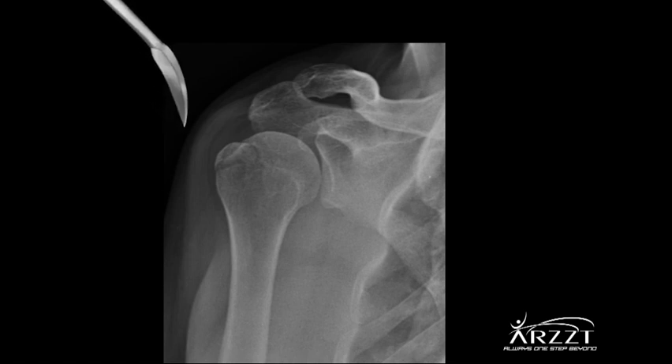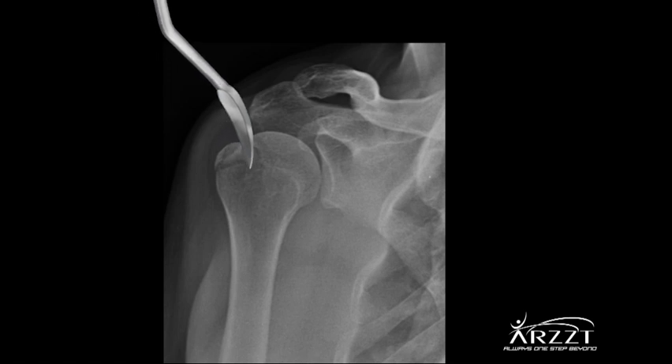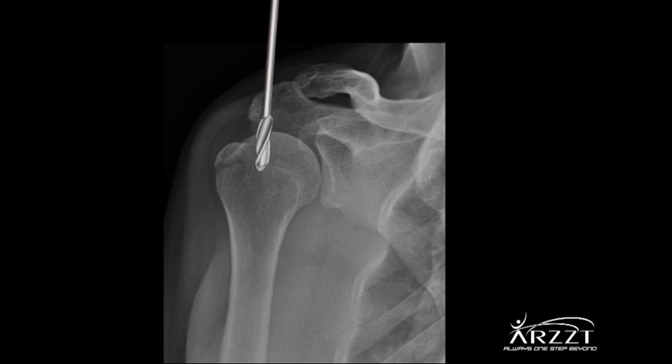The starting broach will be introduced following its curvature, which will be calibrated when entering the medullary channel. Then the 7 and 8 mm reamers will be used to enlarge the channel diameter.